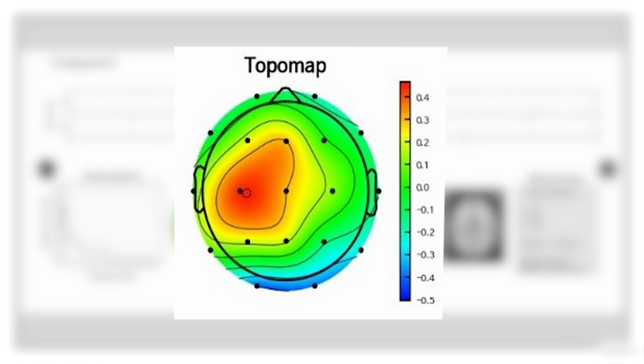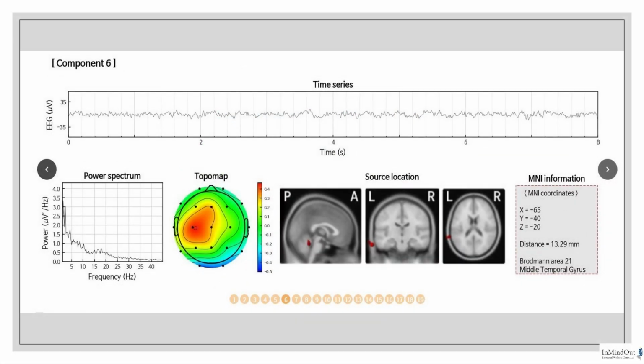And we see that we have a lot more activity here on the left sensory motor cortex. It shows you subcortically with the red dot where the activity is coming from, and it gives you specific coordinates, specific voxels, which tell you with pinpoint accuracy the area of the brain that is affected, what it corresponds to, and what kind of activity and functioning is being impacted.